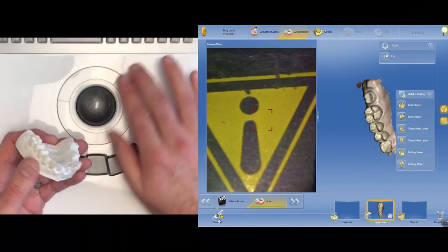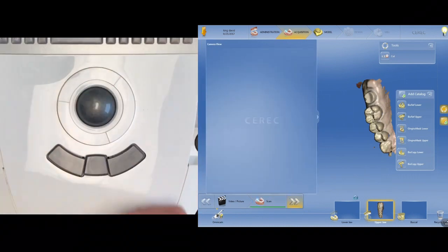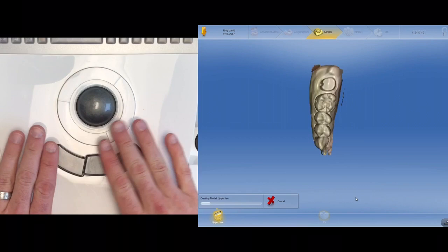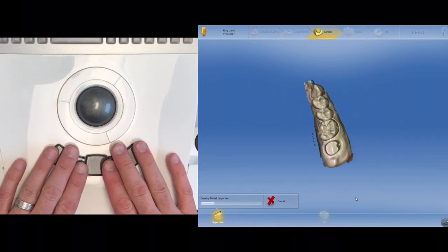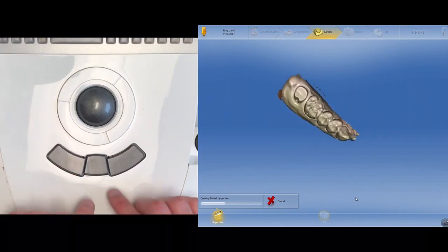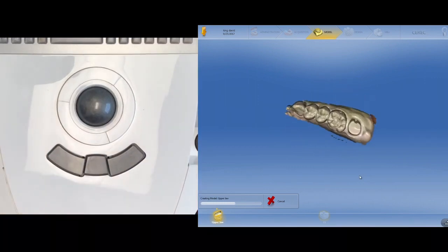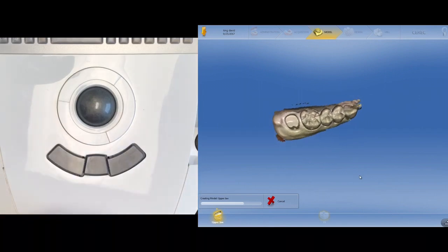All right, so let's move forward. Turn that camera off. We're going to move forward. I'll walk you through a couple of those steps that we did in the last video just to make sure that you're comfortable with hand position and what each of these buttons do. In my experience coaching assistants and doctors alike, one of the most awkward things for someone who's just starting CEREC is figuring out how to use the ball and how to use the three buttons with regard to what they do and how to do that.